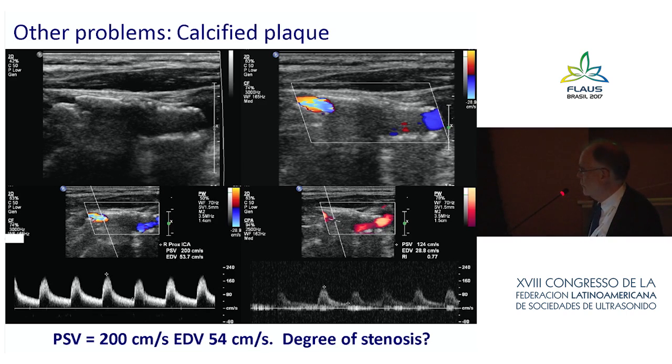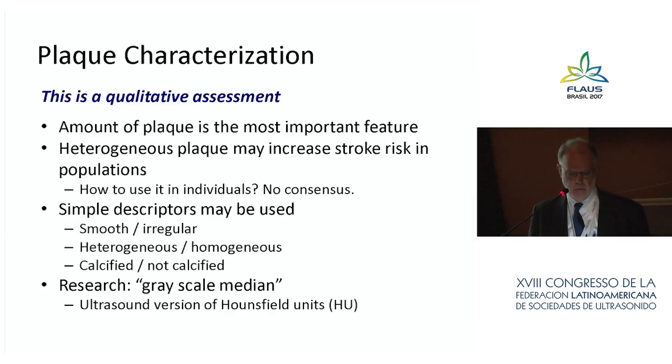So we can't get any sonographic information from this area here, but just distal to it, we see a relatively nice spectrum, but elevated velocities. So probably there's a significant stenosis in here that we cannot identify. Little pulsed power Doppler shows us some flow here, probably also consistent with a greater than 50% narrowing.